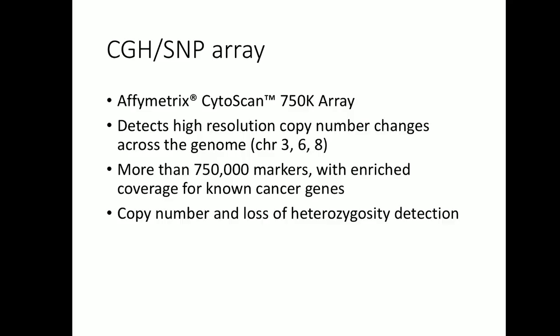Why we're using the SNP array, I think, is because we can get a whole-of-chromosome picture, we can get quite high resolution, and it looks at multiple genes on each of the chromosomes. And there's a handout out the back if you're interested in this particular test.